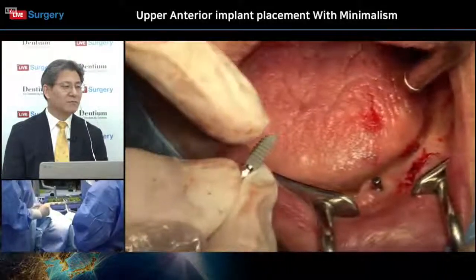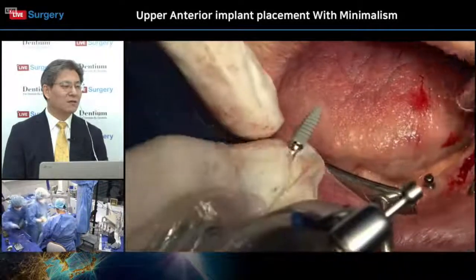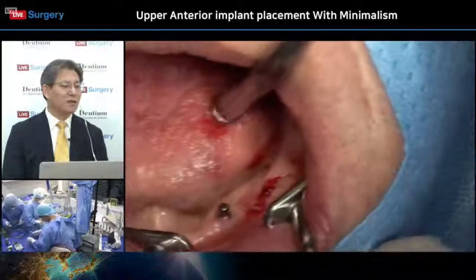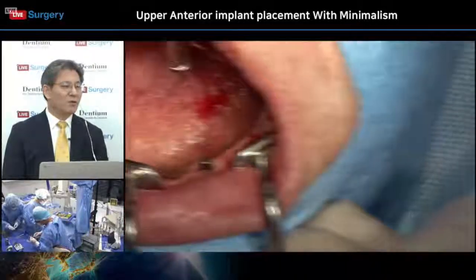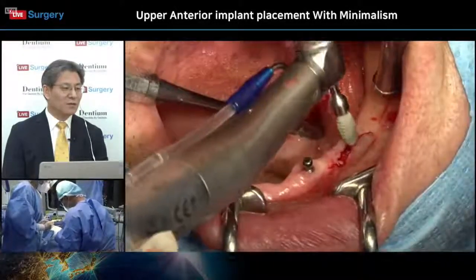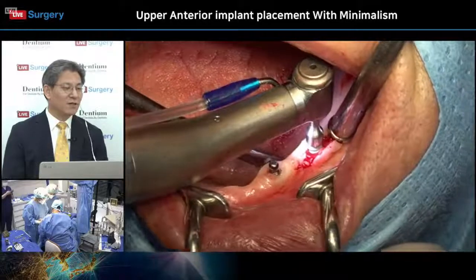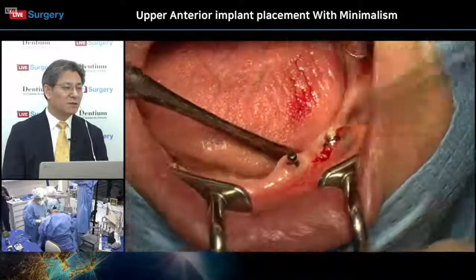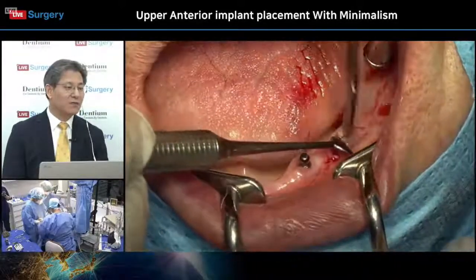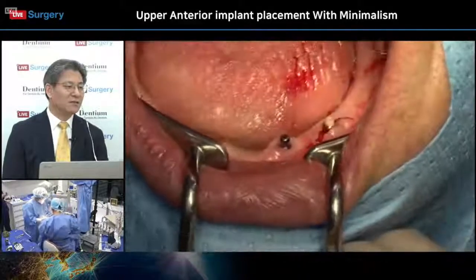Because the implant shape is such that the mid size is wider compared to the crest size. So, okay. However, we place the 4.0, but actually the neck is 3.7 or 3.8. I see. The neck portion of the fixture is slightly smaller than the body size. So the platform top portion is slightly smaller than 4.0, right? So, it is another unique point of the Bright implant system. Yeah, already done with the fixture and sutures. Yeah, suture.